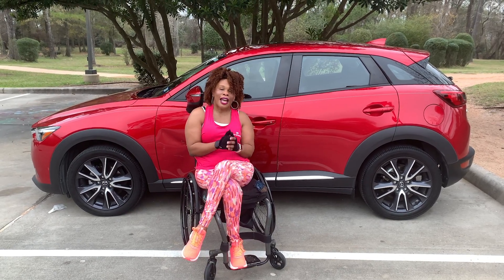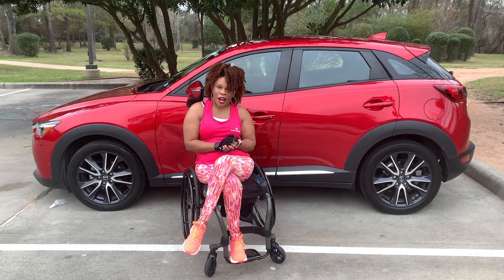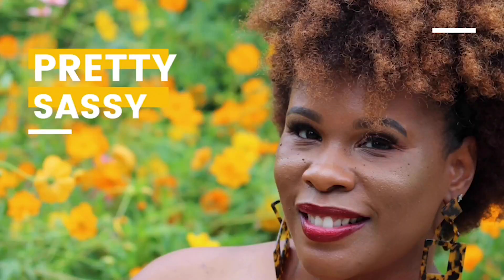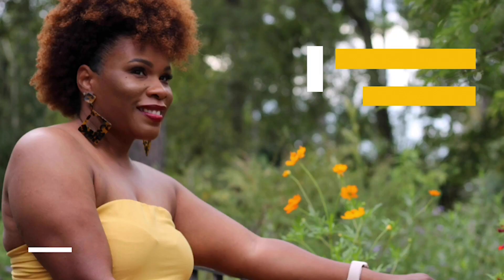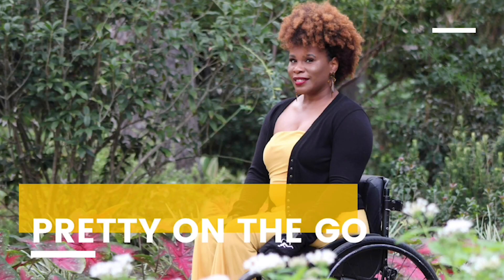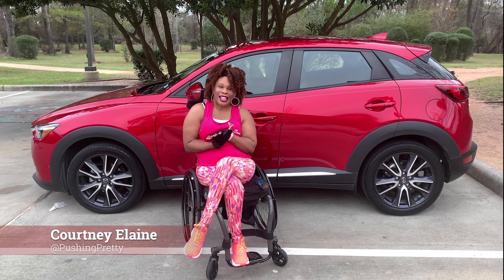I'm going to show you guys today exactly how I drive, how I get in and out of my car, and how I get my wheelchair in and out of my car. Pretty sassy. Pretty trendy. Pretty on the go. Pushing pretty. This is Pushing Pretty with Courtney and Lightning.